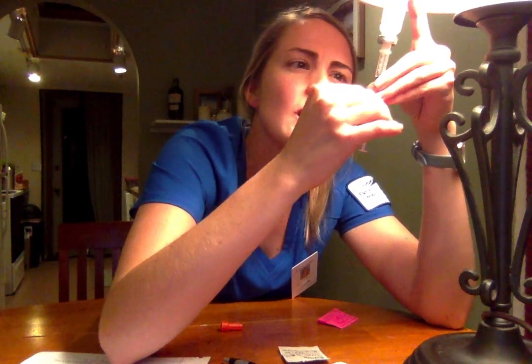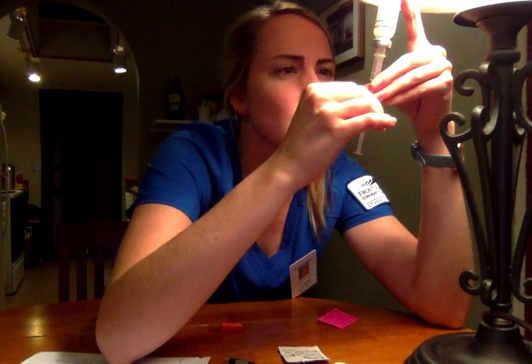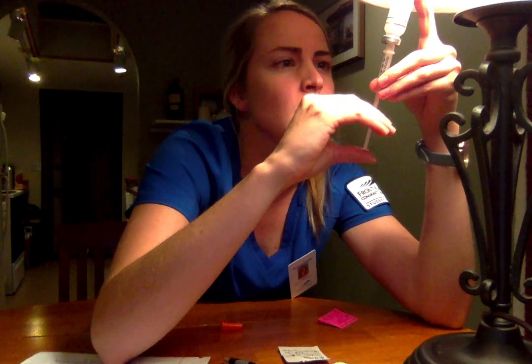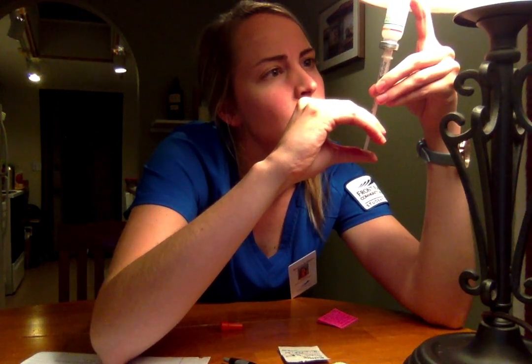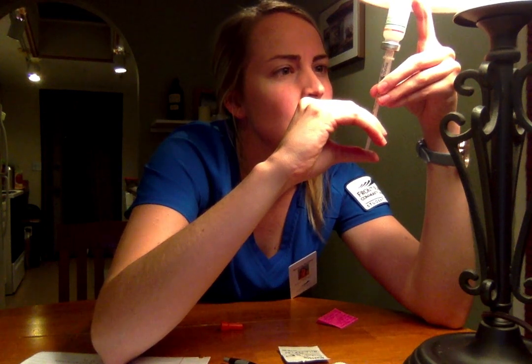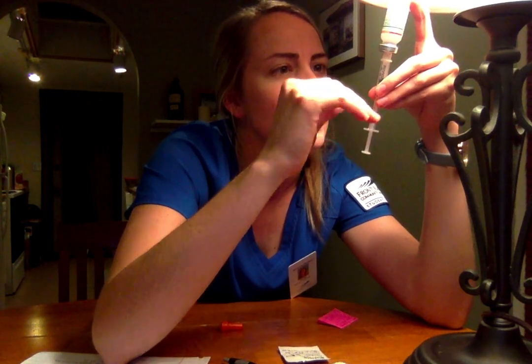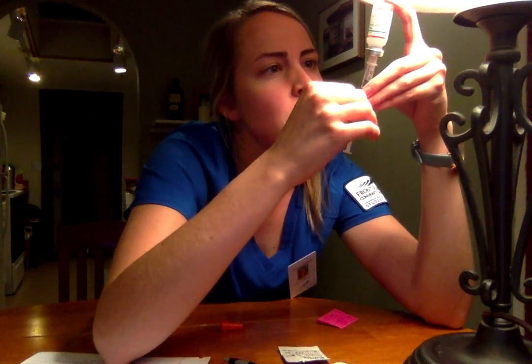Okay. Alright. No bubbles there. I'm going to push up to the marking. Okay. The third tick down, and I'm just going to check one more time.